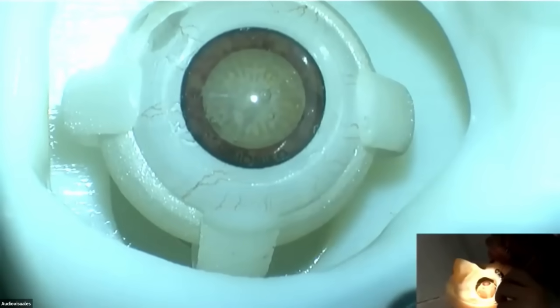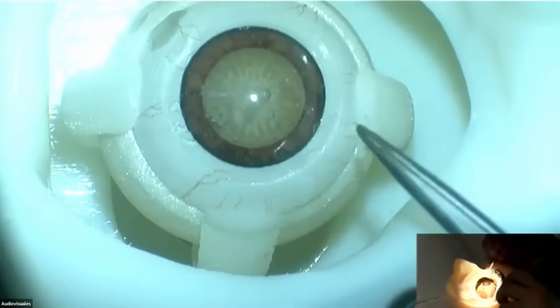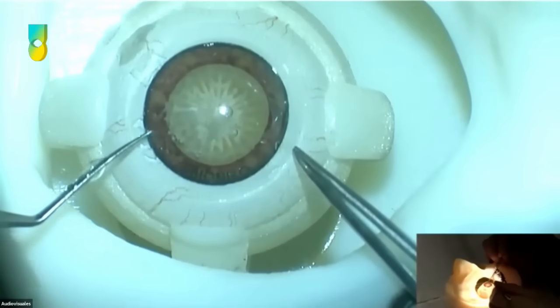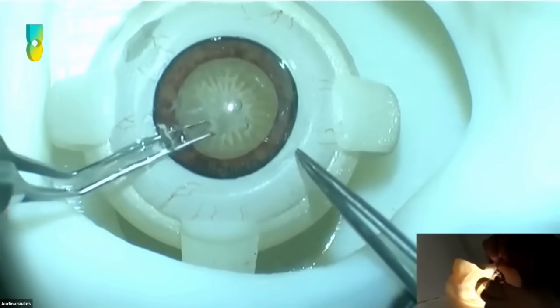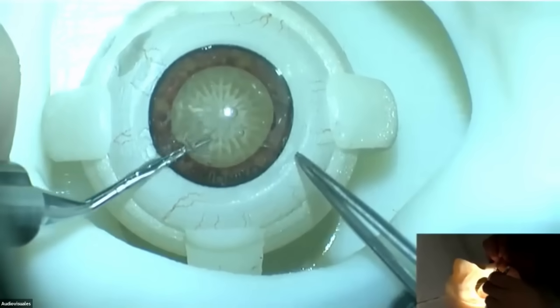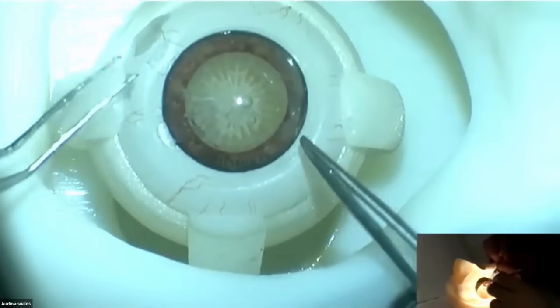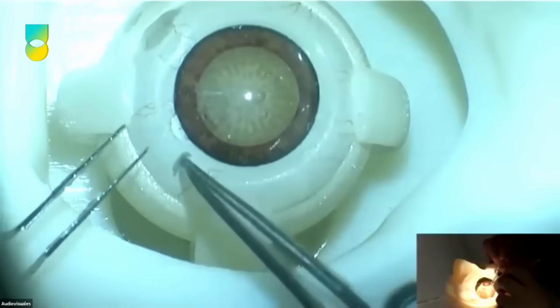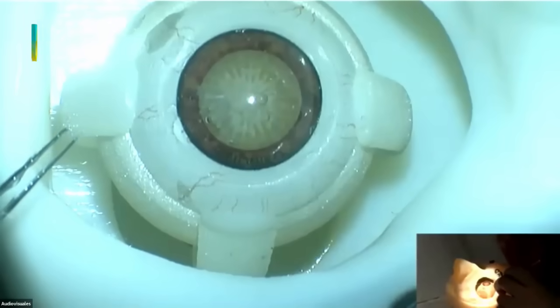You can hold it in this paracentesis and use the main incision to do the capsulorhexis like this. This is the way I usually do it, especially because 99% of my cataract surgeries are topical. So this is my idea. Okay.